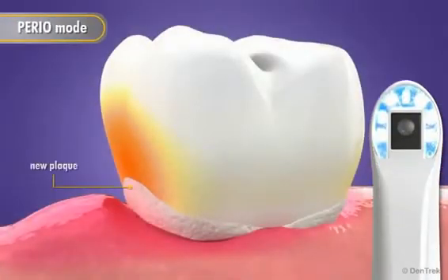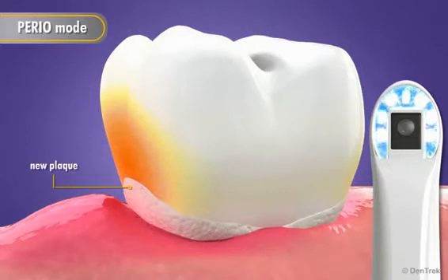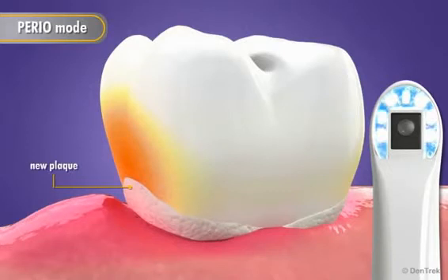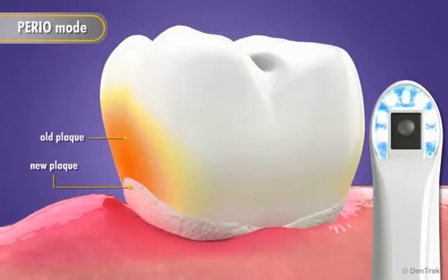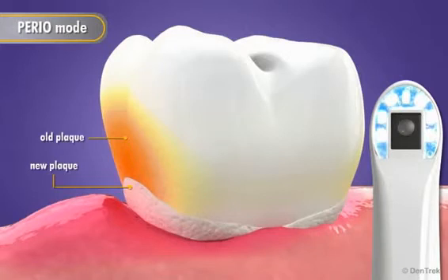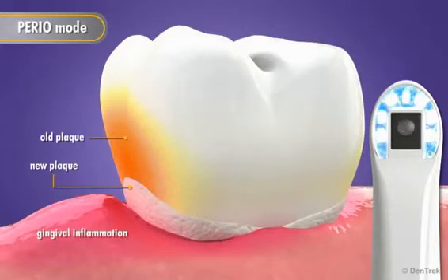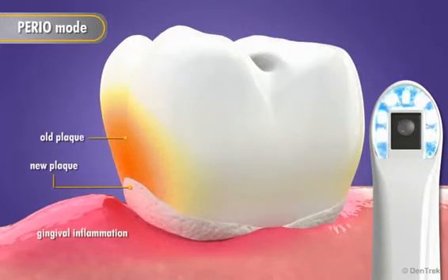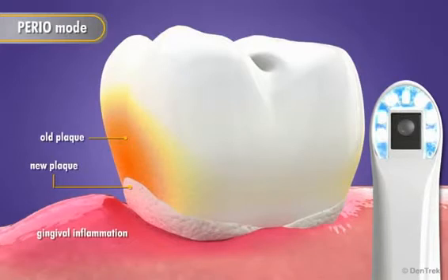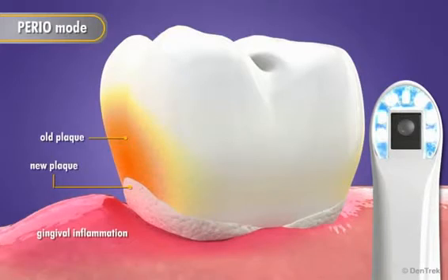New plaque is highlighted by its white and grainy characteristics, and old plaque is revealed as shades of yellow and orange. Gingival inflammation is indicated ranging from pink for mild inflammation all the way to deep magenta for severe inflammation.